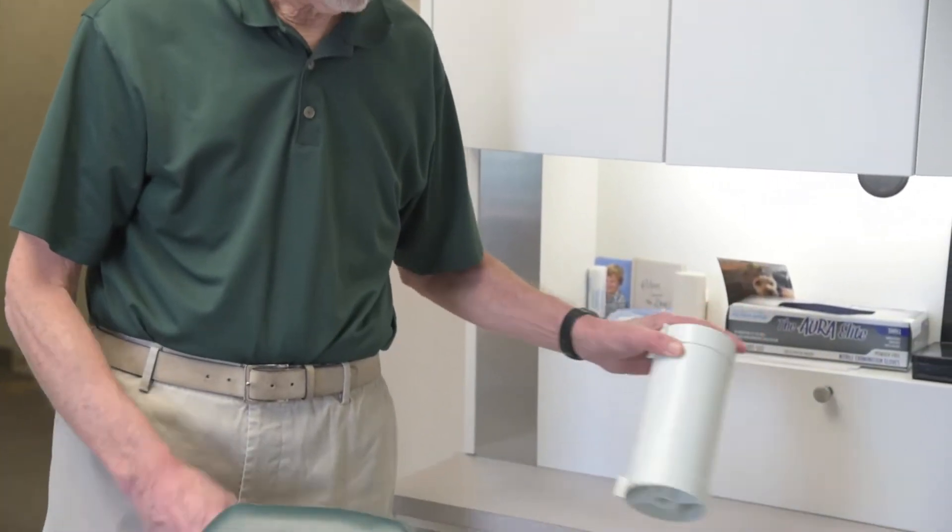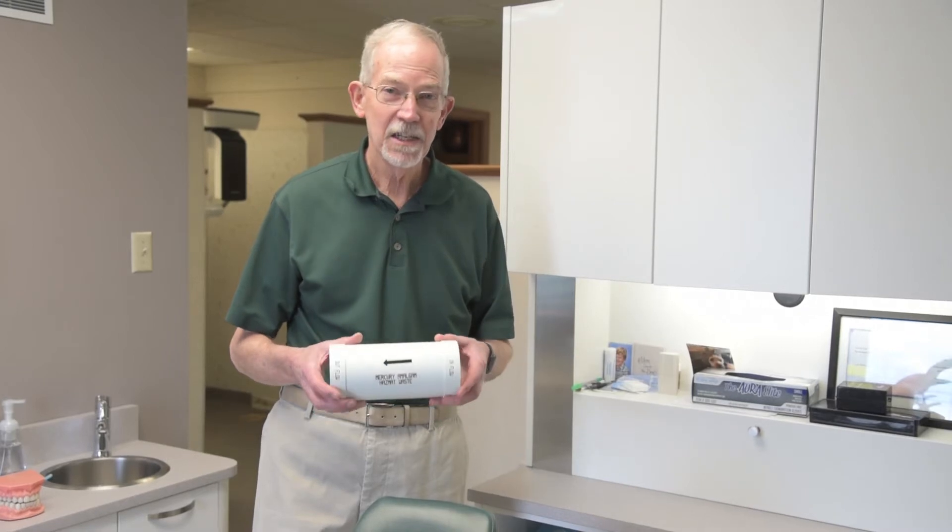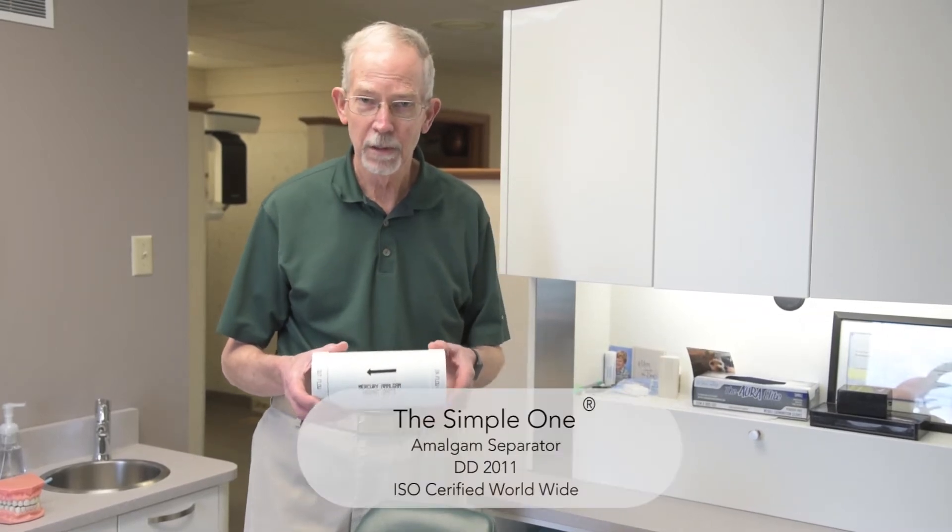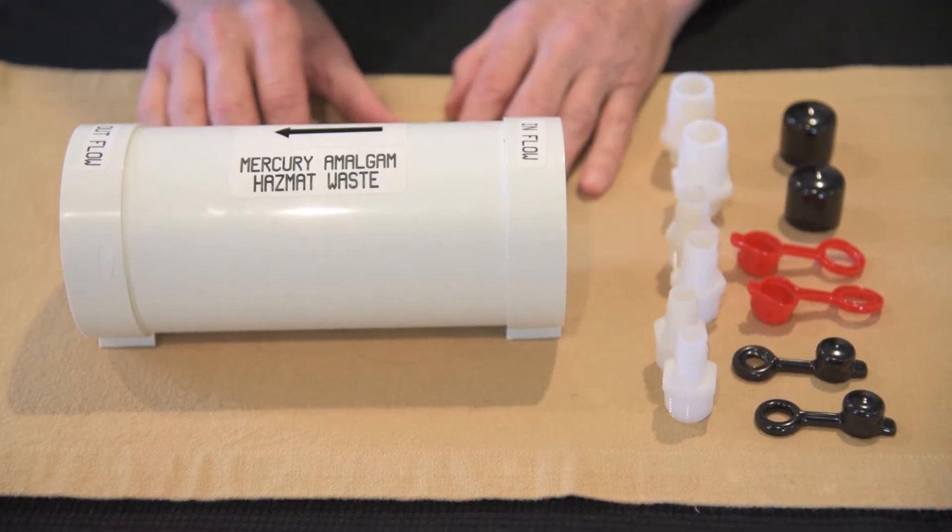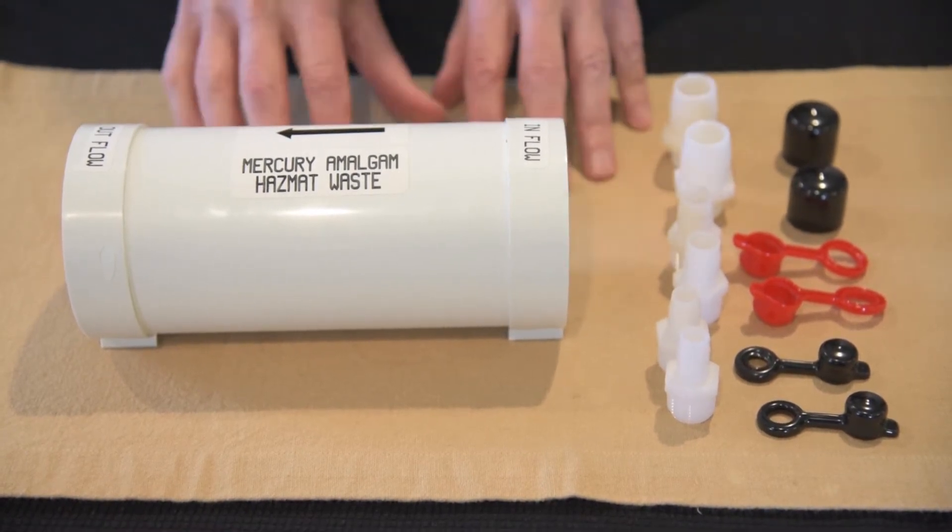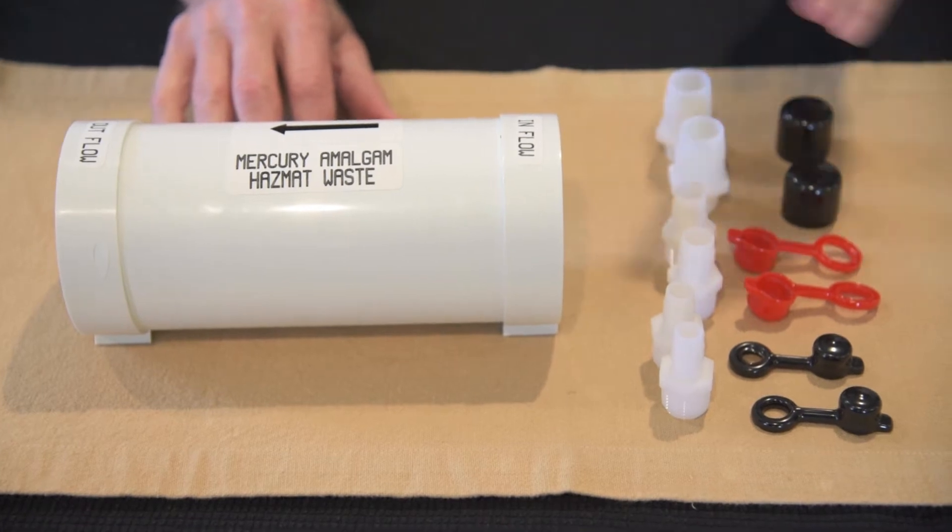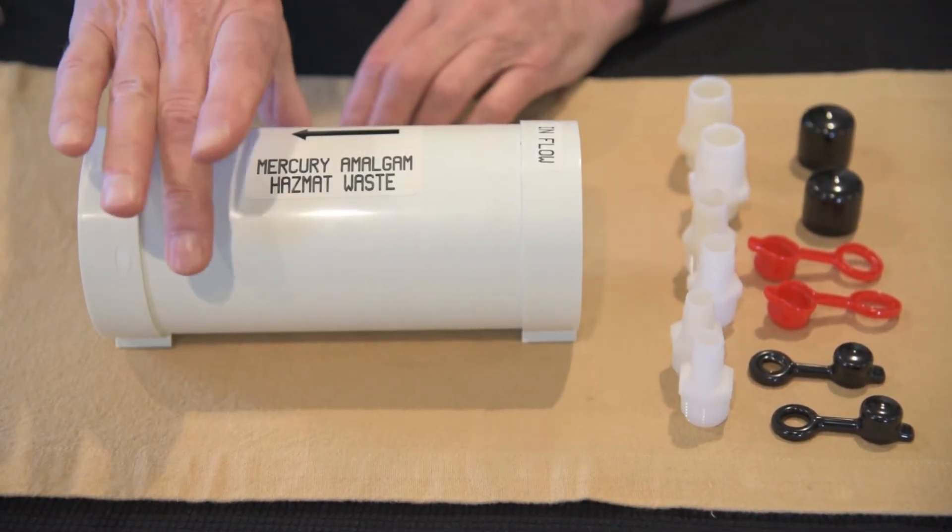The filter we're going to be using here is very easy to install, and it's called the Simple One. I'm going to show you the contents of the package, the parts that you receive when you open up the mercury filter box.